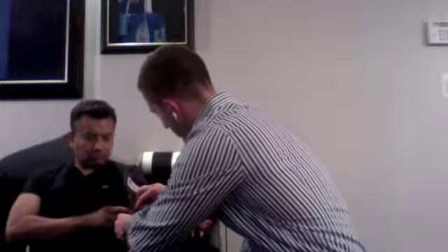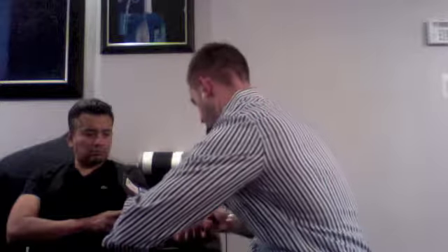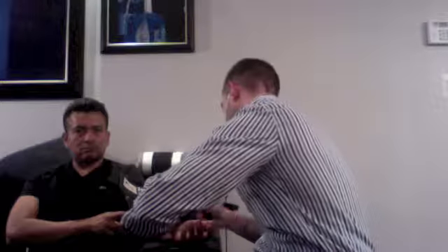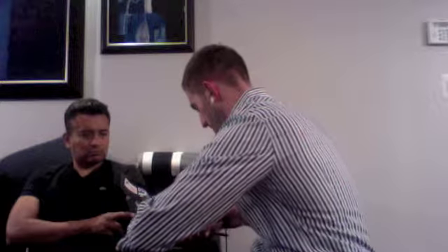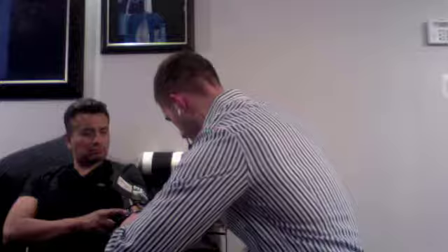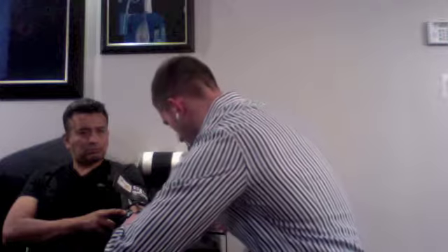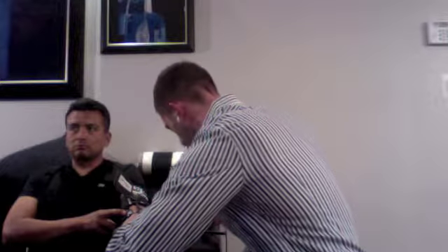So first, I'm going to make the beak out of my stethoscope. So there's the beak. I want to use the diaphragm side, so I want to check it and make sure it's right. You do that by lightly tapping. So, place this on the brachial artery. You might hold that one right. Alright. So I want to get his radial pulse. Alright, I feel it. So now I want to inflate it. Okay, so now I'm going to slowly release it.